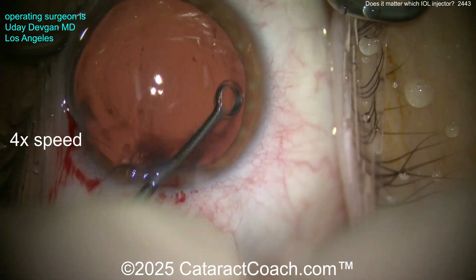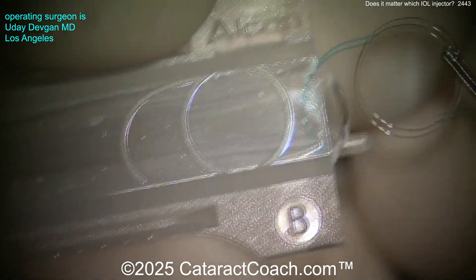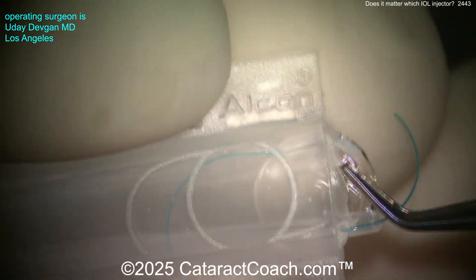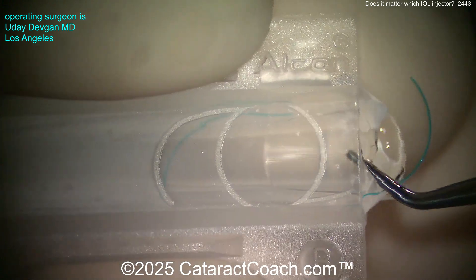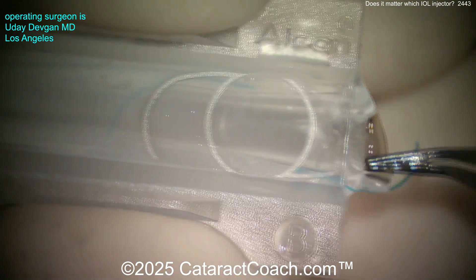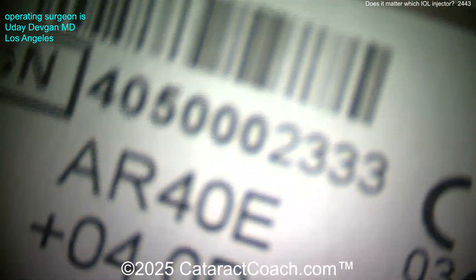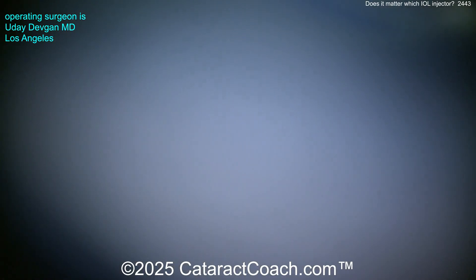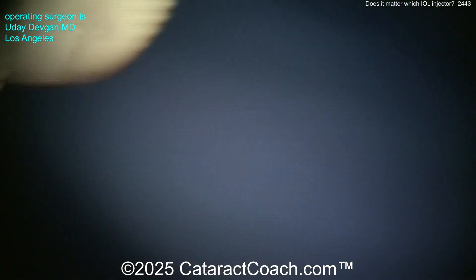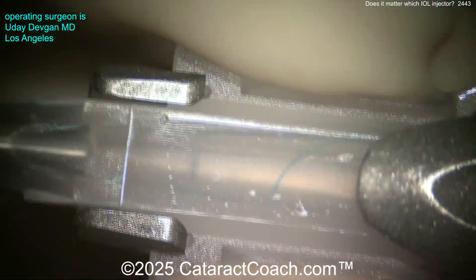The capsule is polished up and looks pretty good. Here's our lens — we're going to place it in the injector. This is an Alcon injector, B cartridge — B like 'boy.' It's easily placed, and there's a picture showing the correct orientation in case you forget the haptic orientation. Remember: S is 'stupid' — you don't want the S, you want the anti-S. The lens is the AR-40e, made by J&J, formerly an AMO lens — again a 6-millimeter optic. You're putting the AR-40 into the Alcon injector. Is that okay?